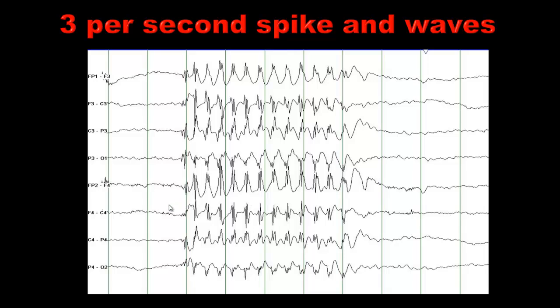3 per second spike and wave — these green lines are separated by 1 second each, and in each second you see approximately 3 spikes and 3 waves, so that's why it's called 3 per second spike and wave discharges. This is a typical pattern seen in childhood absence epilepsy. Patients with childhood absence seizures can space out for only a few seconds, typically 3 to 10 seconds, with no significant post-ictal confusion or disorientation. These need to be differentiated from complex partial seizures, as discussed in a previous tutorial.